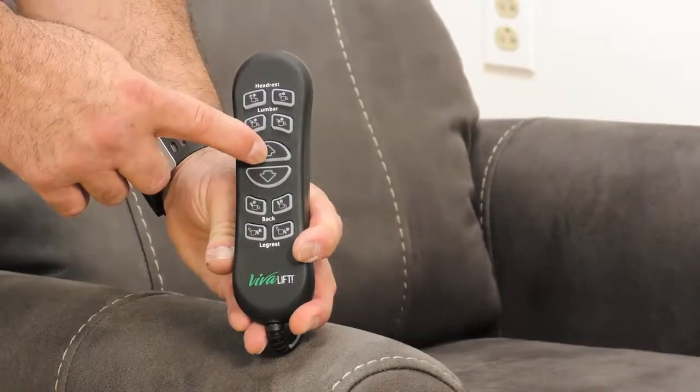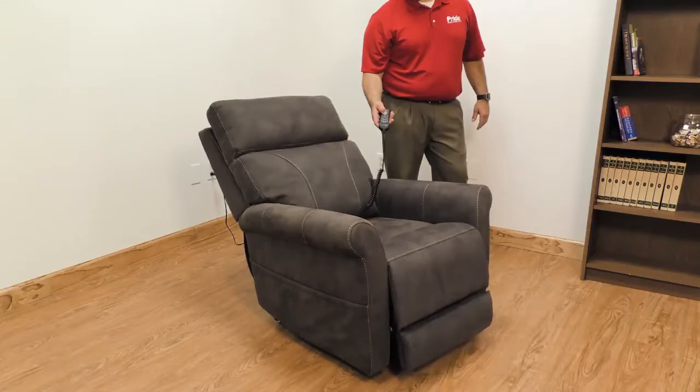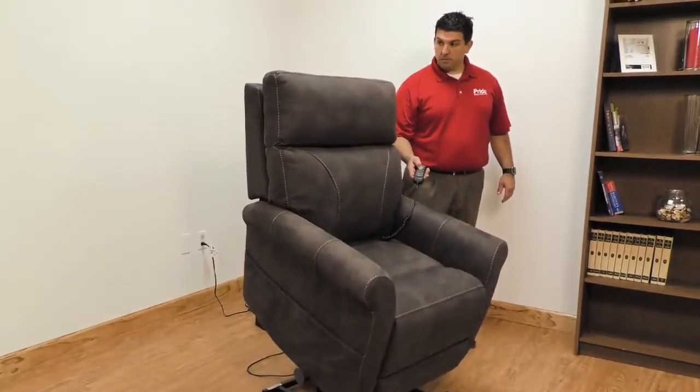These chairs have an all-in-one close-in lift that closes all of the functions as the user is coming up out of the recline position. This feature is operated by the larger push-button arrows.